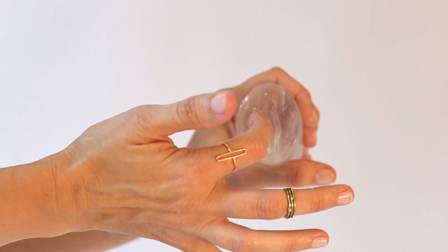Once inserted, the cup should be completely undetectable. Nothing should be sticking outside of your body, not even the stem. If the base of the cup is sticking out, it means that either you haven't placed the cup high enough, you need to trim the stem, or you might have a very low cervix, which means that the cup is simply too long for you. Before you go chopping off the stem, try giving it a trim first and see what's comfortable for you.